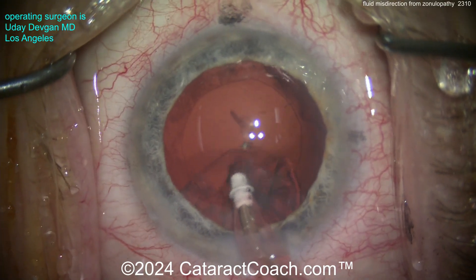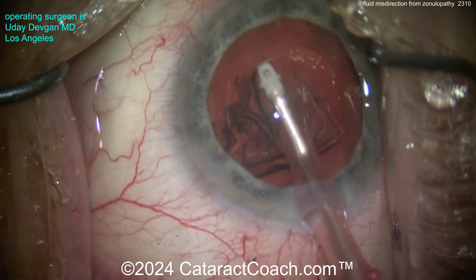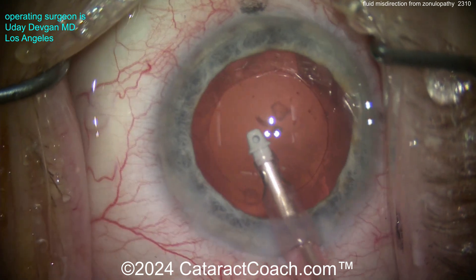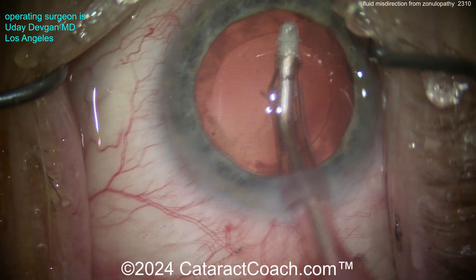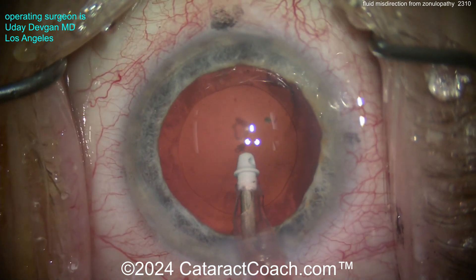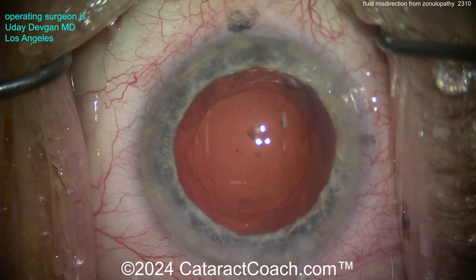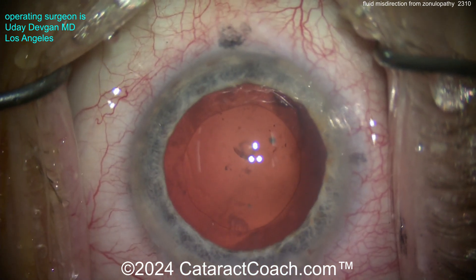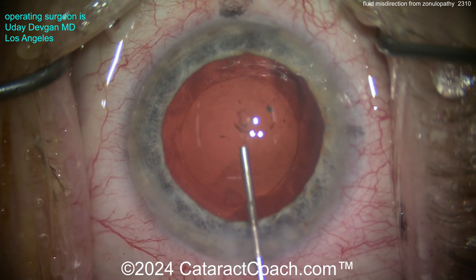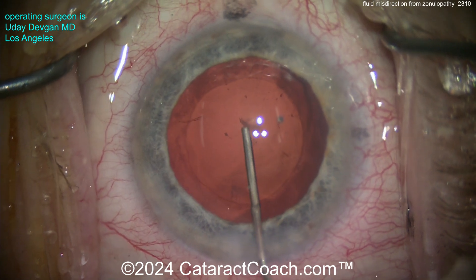Here's a more challenging case. Everything seemed pretty normal during the surgery; I didn't notice any zonular issues. But now look at those two pieces back there — they're behind the posterior capsule. I try to grab them and you can see the wrinkles and striae in the capsular bag. The posterior capsule is totally intact.